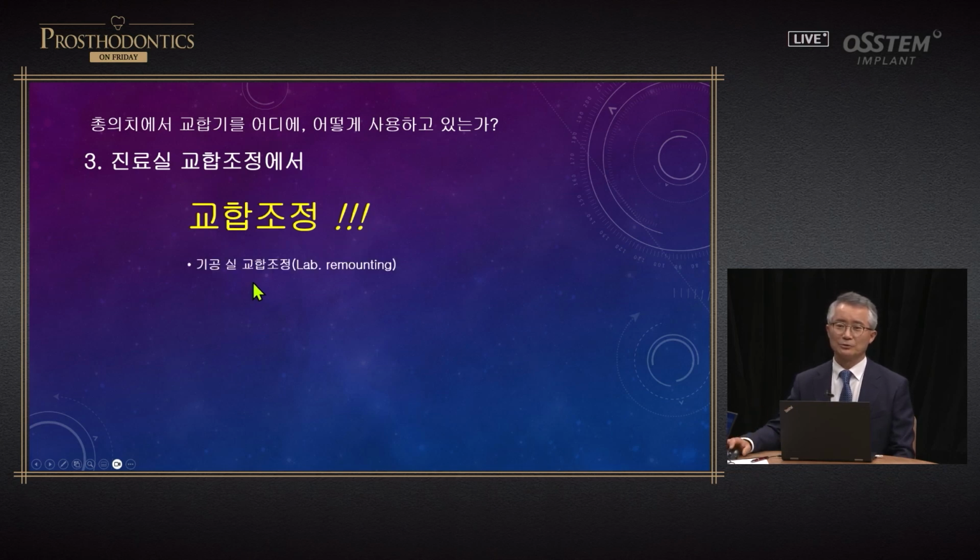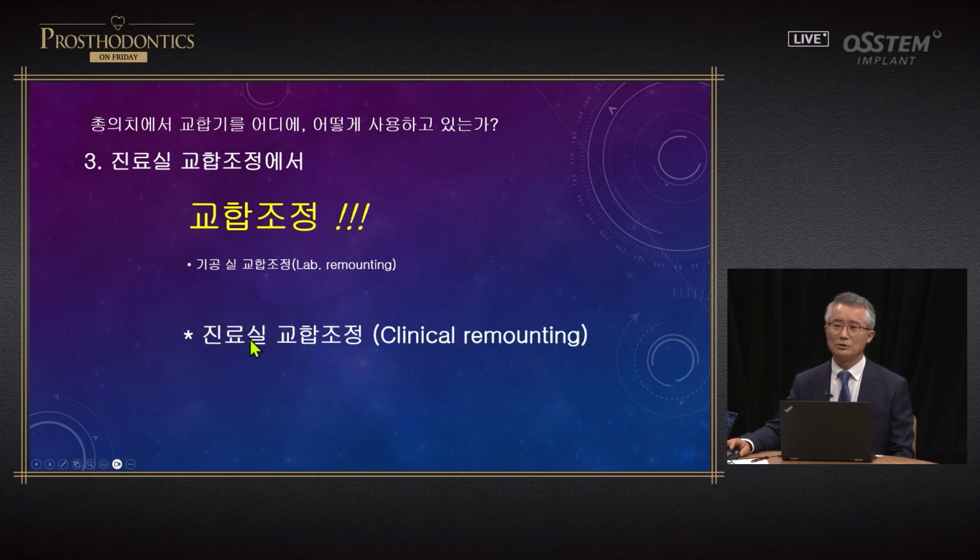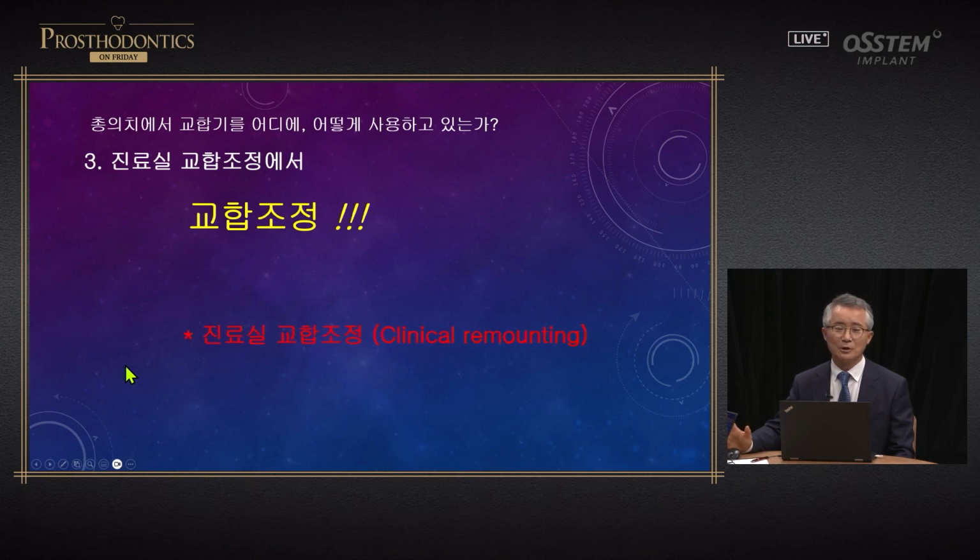This can be divided into lab remounting and clinical remounting. I learned this when I was an intern, and in the past I paid a lot of effort in lab remounting, but these days this is no longer necessary. I do not do this at all. I did it when I was an intern. In terms of clinical remounting, this is very important. I think this is essential.